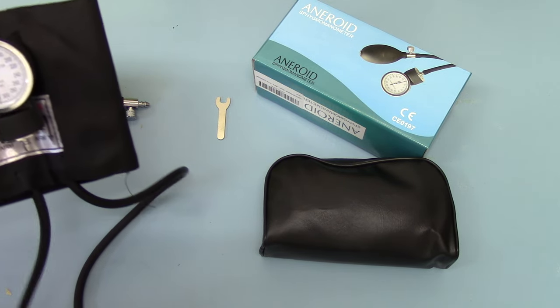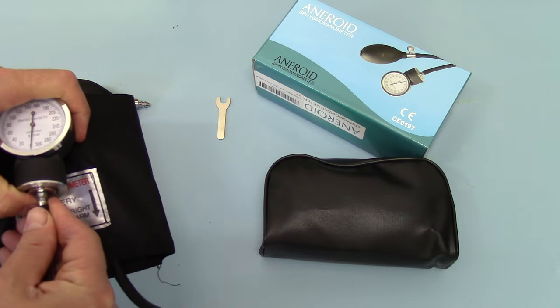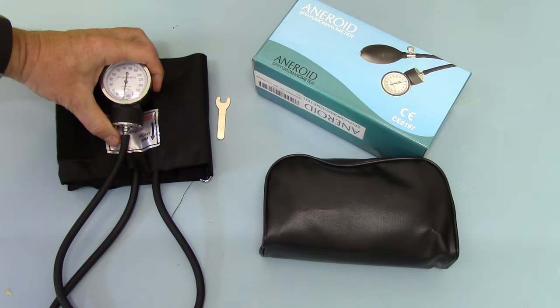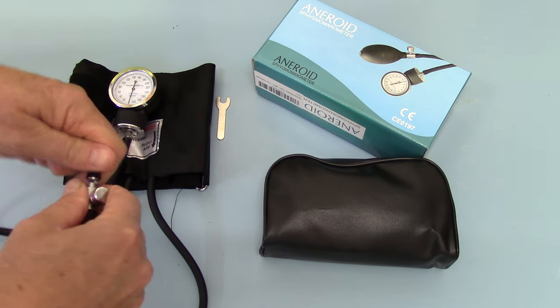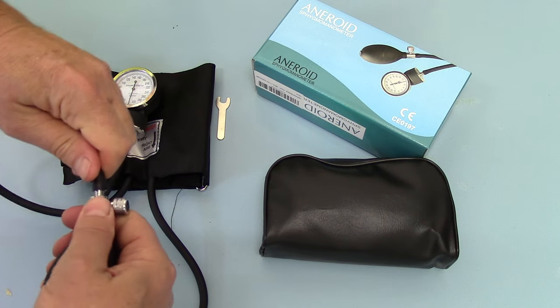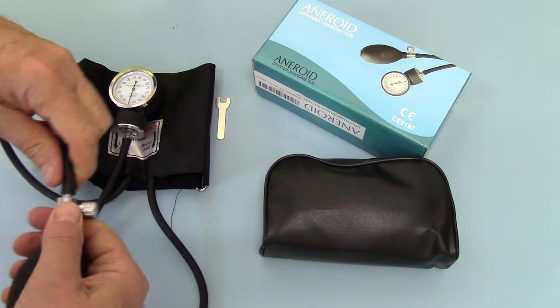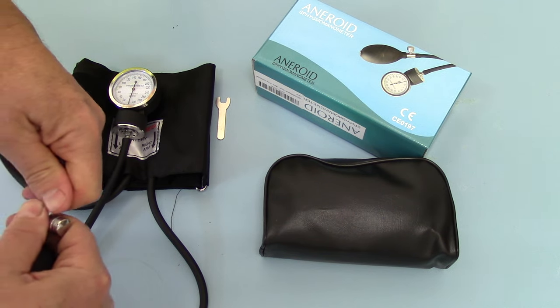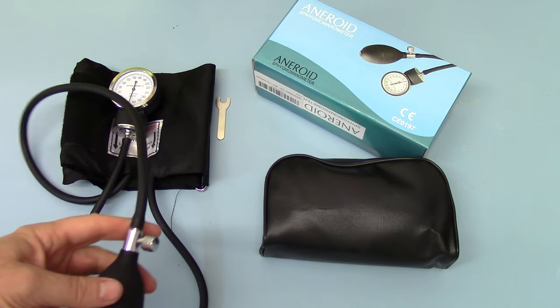One tube goes in — the shorter tube connects to the aneroid sphygmomanometer, and the second tube connects onto the inflation cuff. You need to push these right the way on so that both of the retaining flanges are pushed on. It takes quite a bit of working over to get it nice and tight, as this has to maintain a high pressure.